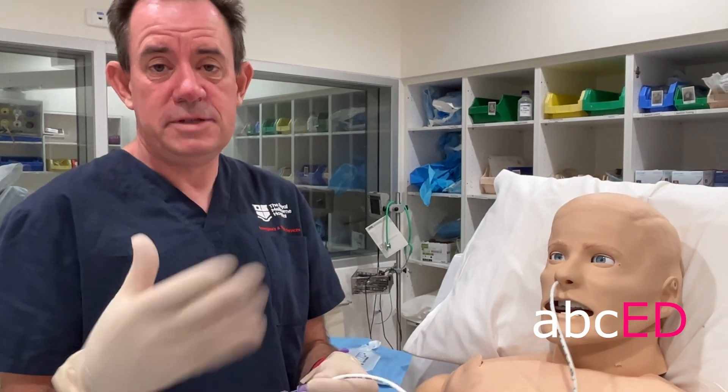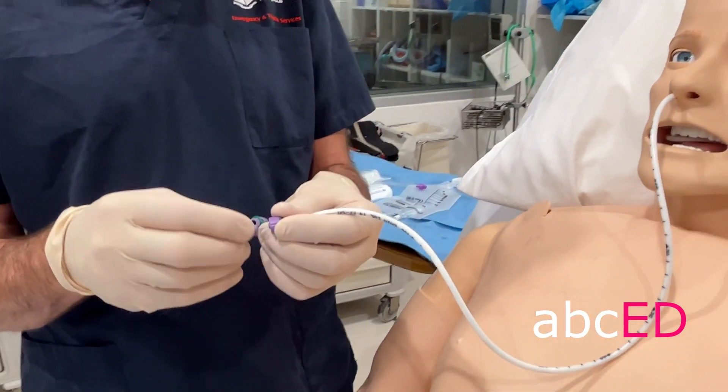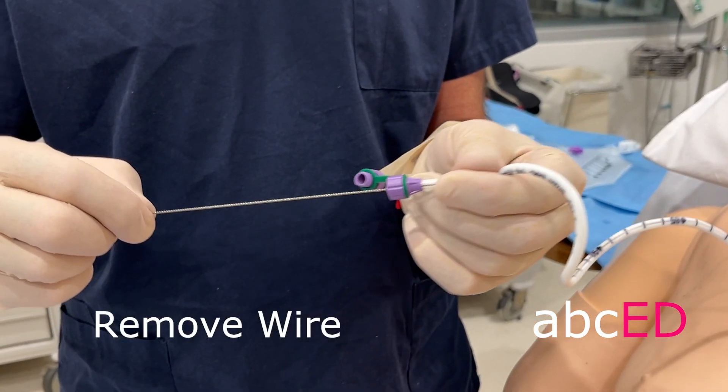Some of those gastric tubes come with a wire stylet, some don't. This one does to make it stiffer and easier to put in — you just unscrew the end and out that wire comes.